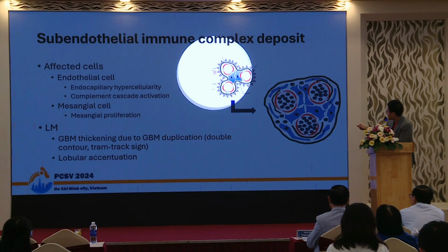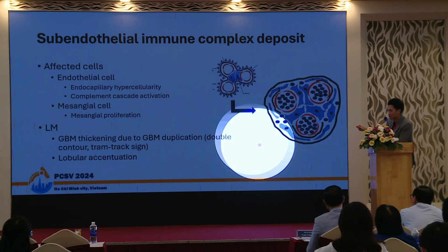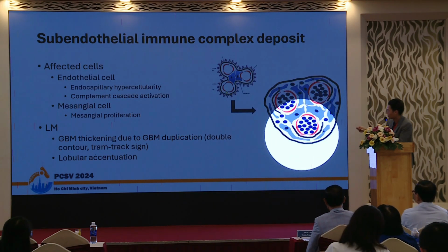It makes this lobular configuration of the glomerular structure.